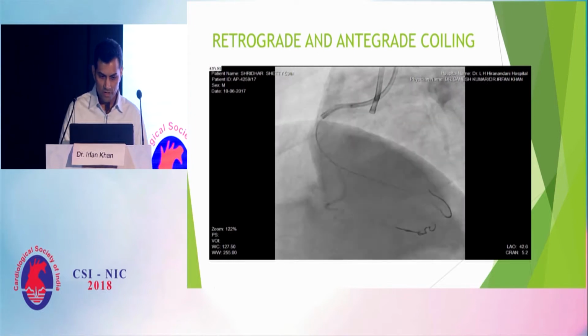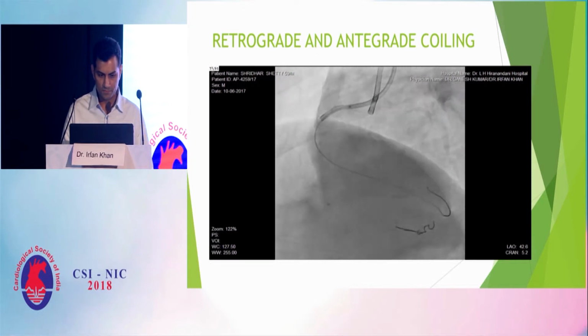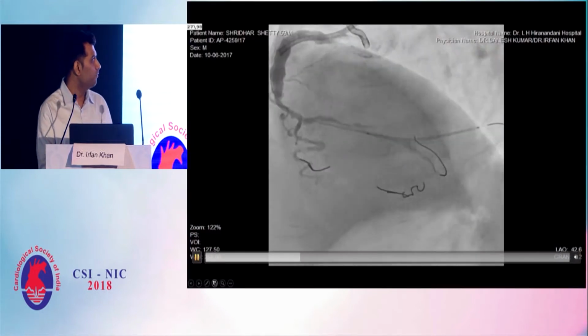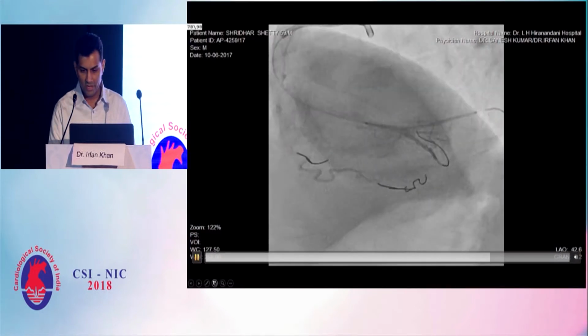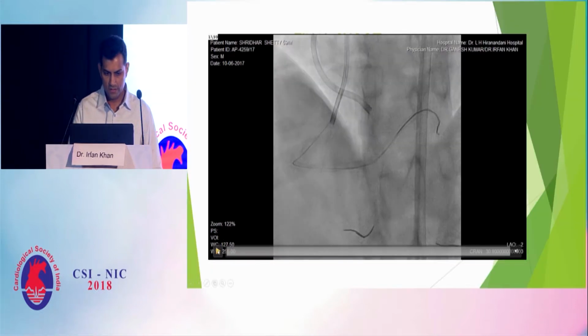And that is the point where we decided that we have to close the antegrade limb of the feeder vessel. Then we successfully closed the antegrade limb of the feeder vessel and completed the case. And then this is the final picture.